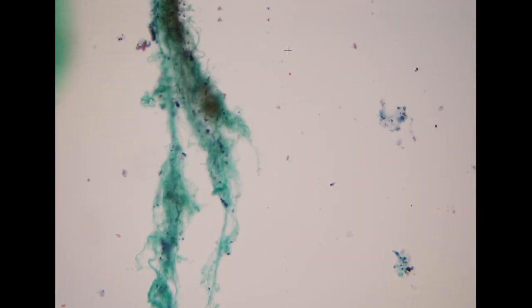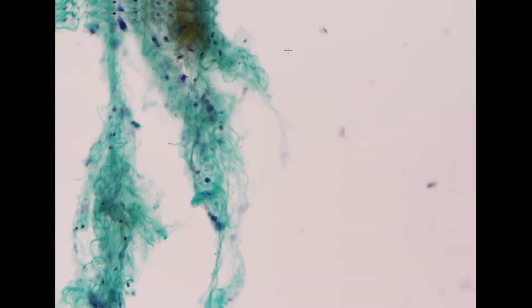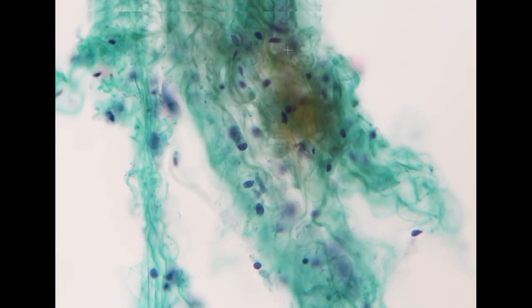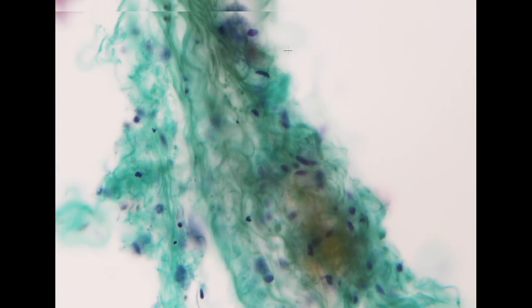This specimen is particularly interesting because it demonstrates a finding that I actually rarely see, which is a stromal component with very bizarrely arranged collagen fibers.